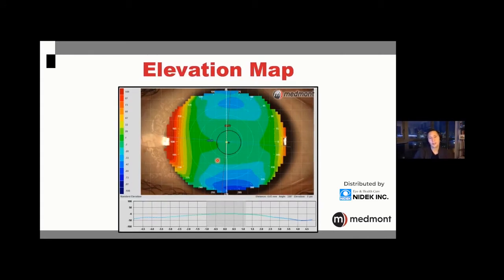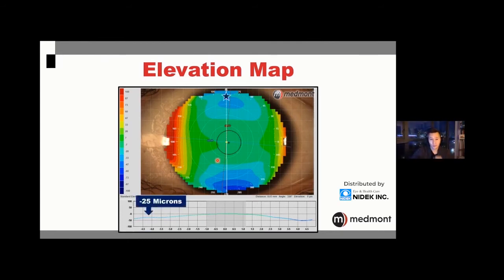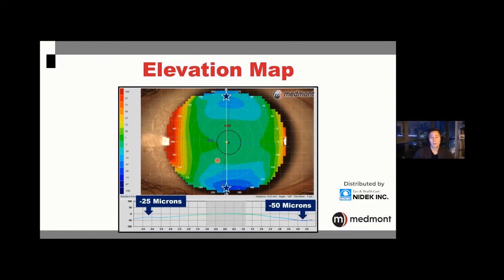In the tangential map, we see the ring of landing of our lens, indicating the contact lens might be a little loose — hitting the corneal apex, riding a little high, creating a junction in the corneal surface. Looking at the elevation map, red shows where lens bearing is hardest. At 12 o'clock we have minus 25 microns of elevation, and heading toward 6 o'clock it drops by 50 microns. This means the cornea is much steeper in this meridian and that elevation drop allows the lens to rock back and forth, suggesting we may require a toric lens.